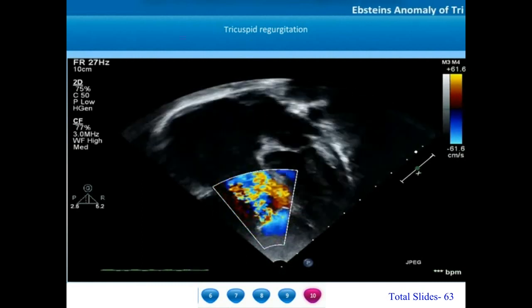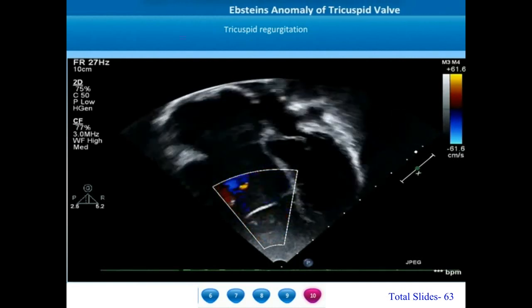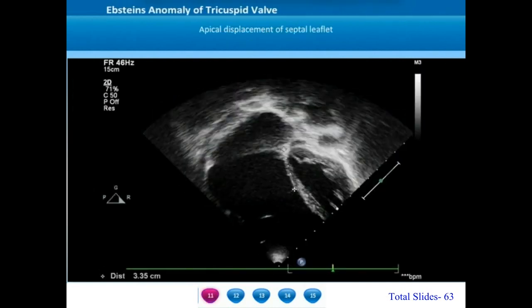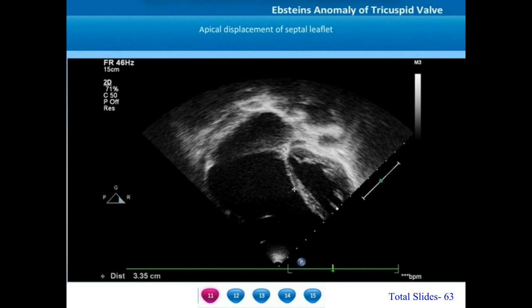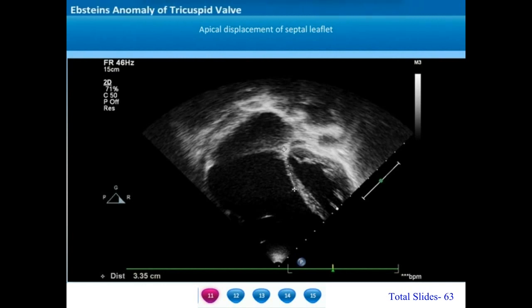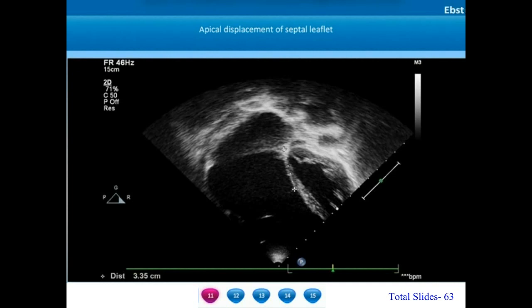However, the anterior tricuspid leaflet's mobility is normal. In this Carpentier type B Epstein's anomaly, the septal tricuspid leaflet is pushed down about 33 mm towards the apex. Whenever the displacement is more than 8 mm per m² body surface area, it is considered a significant displacement. We can also appreciate the significant dysplasia of the septal tricuspid leaflet; it is hardly appearing as a tiny nubbin of tissue.